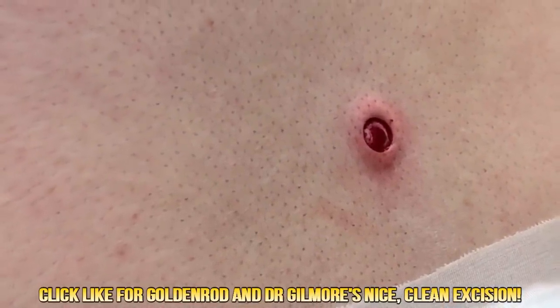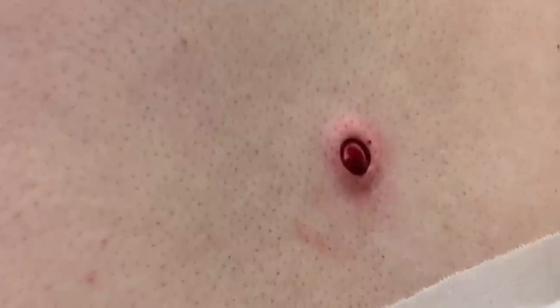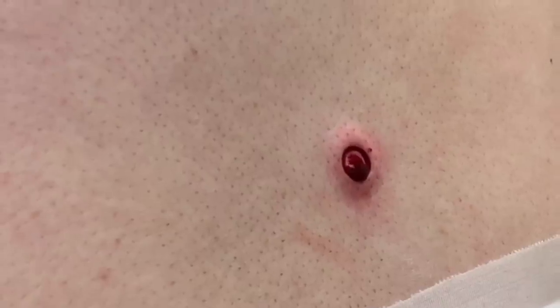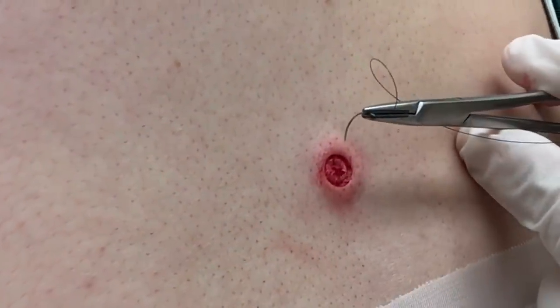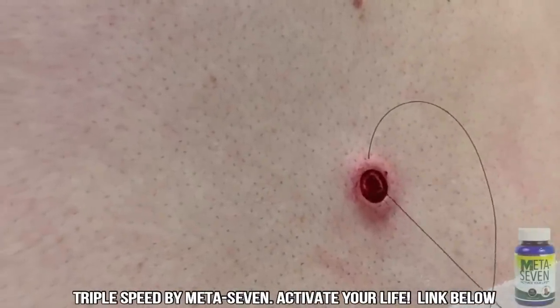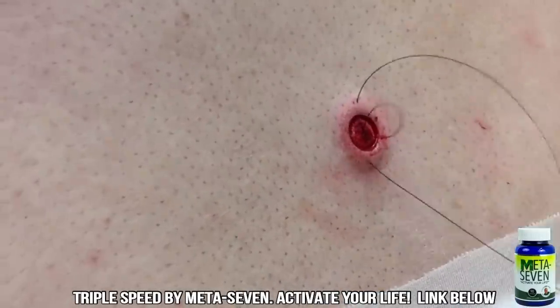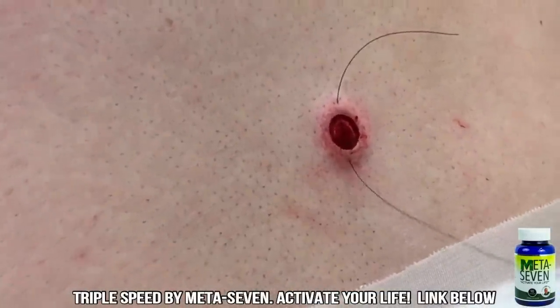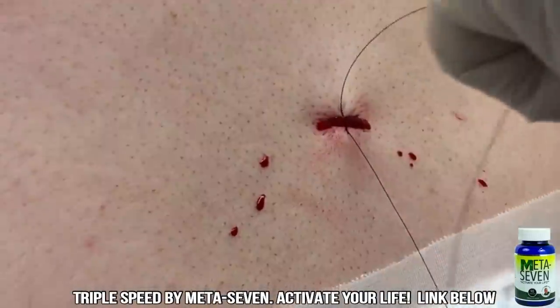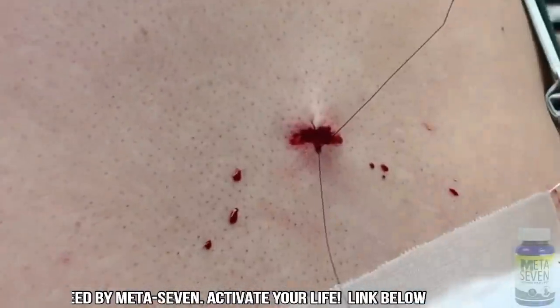And we'll send this to the pathologist, and the pathologist will tell us that it is a benign nevus, right? Which is a mole. And will not need to have anything else done. Hopefully, but I'm pretty sure it is. You didn't feel any pain? No, not at all. Good for you.